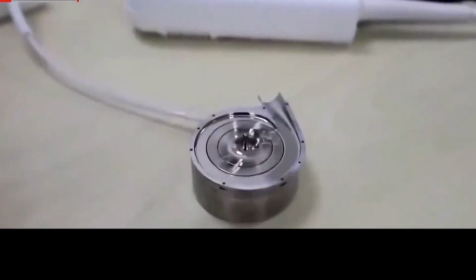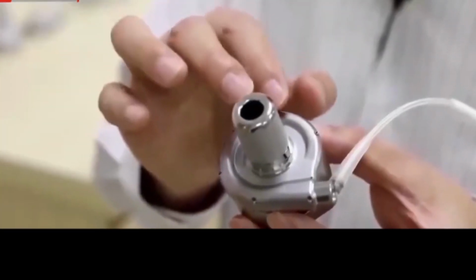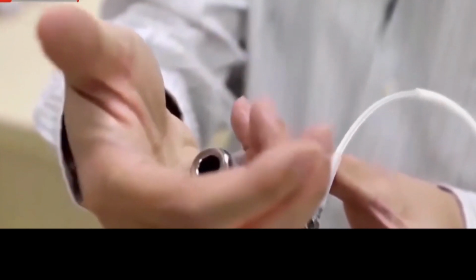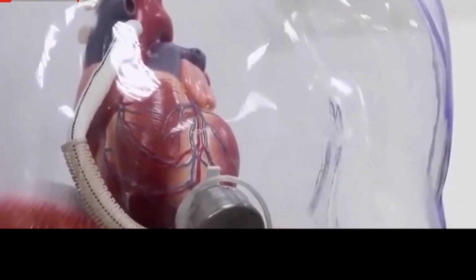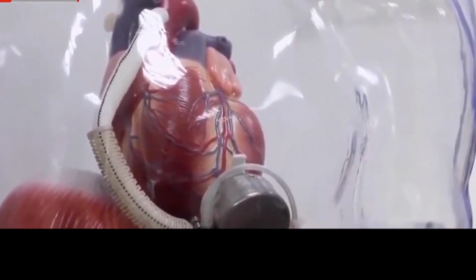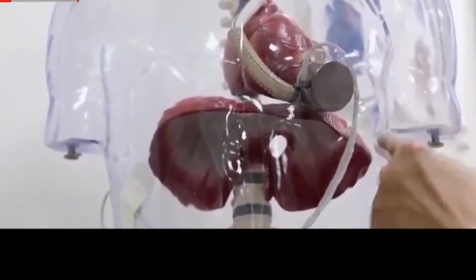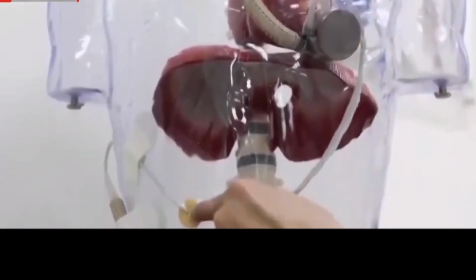After 100 days, the child's heart function was restored and the pump was successfully withdrawn, achieving reversal treatment for heart failure. In February 2023, the affiliated Children's Hospital of Zhejiang University School of Medicine successfully implanted coheart6 for a 12-year-old child with end-stage heart failure who weighed only 30.2 kilograms, setting a new record for the minimum age and minimum weight of pediatric artificial heart transplant patients in China.